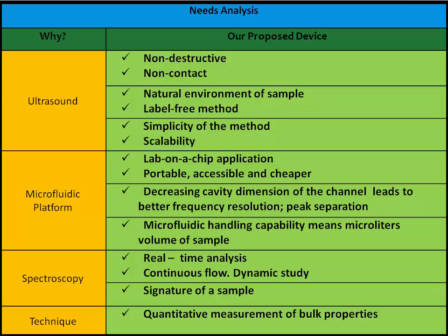Okay, so Megha has listed a number of different potential advantages of using ultrasound for this sort of method. A lot of you are probably familiar with gravimetric sensors. Again, small molecules like glucose are very difficult to actually get to work with that technique. But again, with gravimetric sensors, you've got issues in terms of surface preparation and surface contamination and so forth that you have to deal with. So if you could potentially integrate all of that into a compact platform, that would be quite interesting.